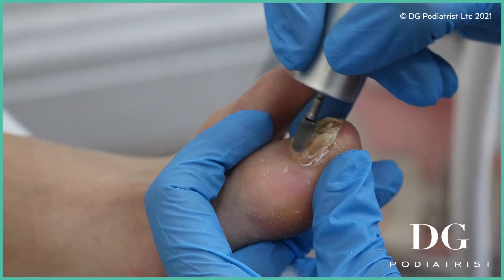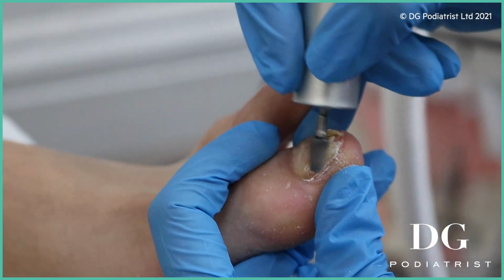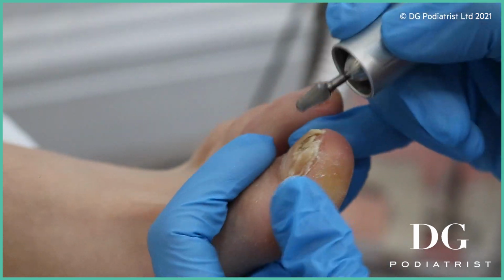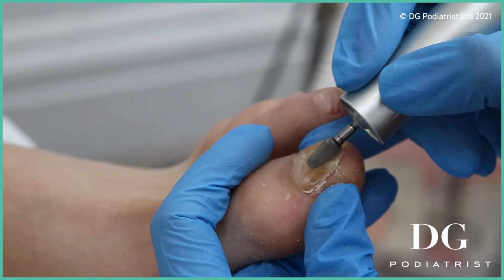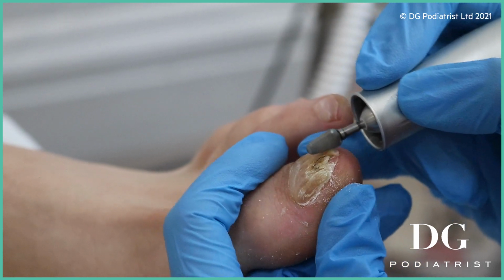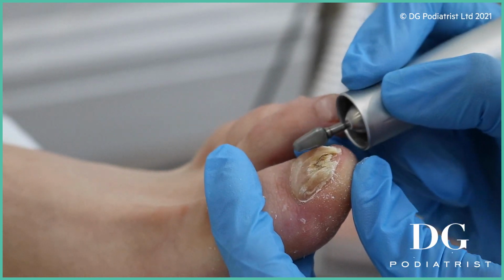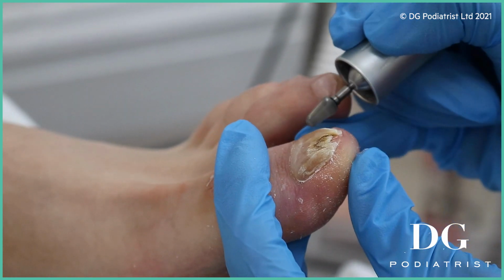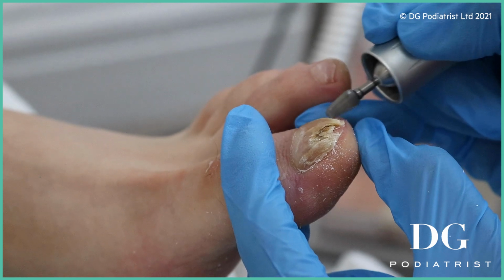Now, the box says that you have to use these small little files. And I often don't find these files to be very effective. So the tools that I'm using are really helping, one way to think about it is like exfoliating the top layers of the nail, so we can really get to the sites that we want, so the active ingredient can penetrate and work more efficiently for the 7 days.